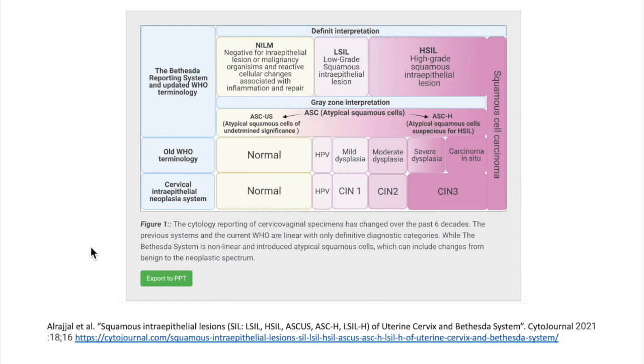Thus, the goal of this presentation is to show that ShapeGenie can quantify precise steps in these gradients and that it provides the potential to derive an objective and quantitative staging system that can discover unknown subtypes in a way that unifies all three systems into one objective and refined system.